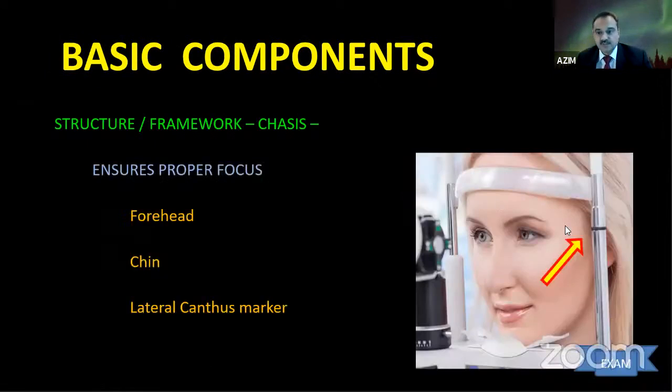This is the joystick, which moves in different directions: right, left, top, and bottom. And also we have the canthal marker here, where it's important that the patient aligns the lateral canthus with this for you to get a proper view. It's important to make sure the forehead is pressed well and the chin is pressed well. And this position makes your life very easy.